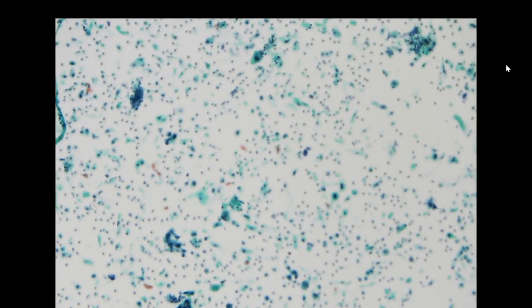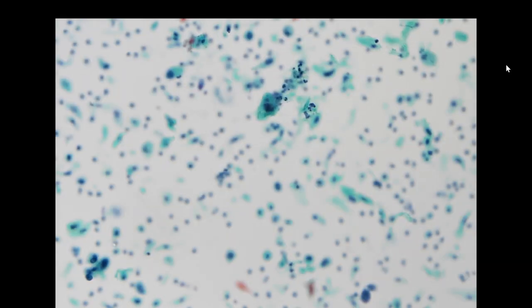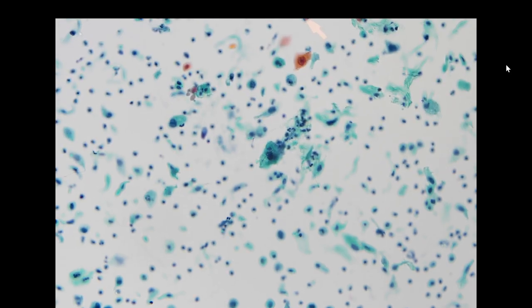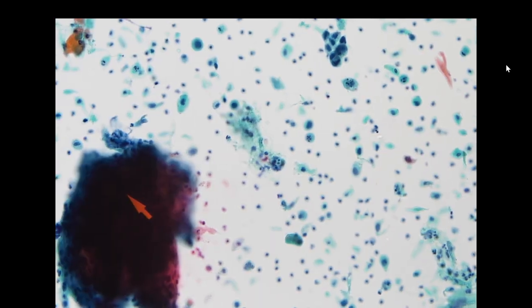So the next specimen is a parotid gland aspiration. In this specimen, just on low power, we have a cystic, kind of necrotic background, and then we start to see some keratinized cells. In the background, we have a lot of cells that look hyperchromatic, some looking necrotic with a spindle morphology. So this is classic for a squamous cell carcinoma.